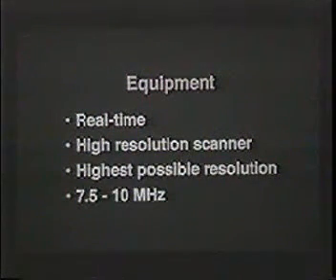But nonetheless, it should usually be performed at 7.5 to 10 megahertz. However, occasionally 5 megahertz is required for penetration of the dense or thick breast.